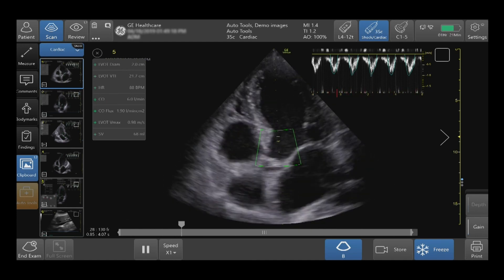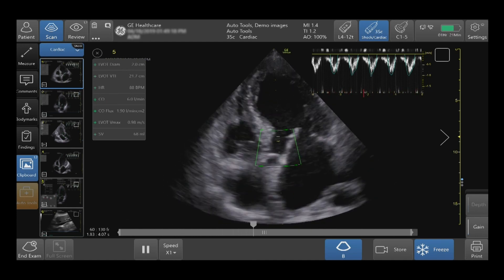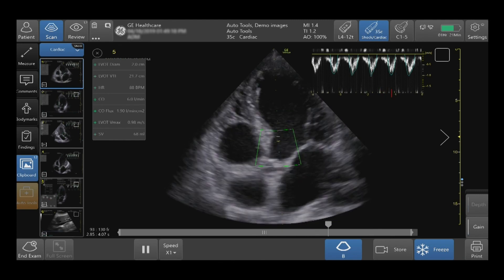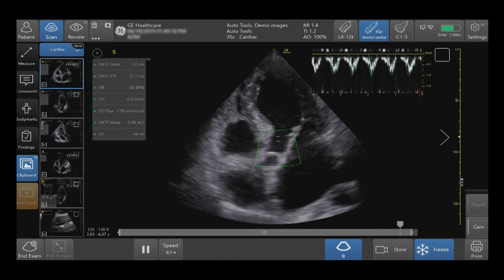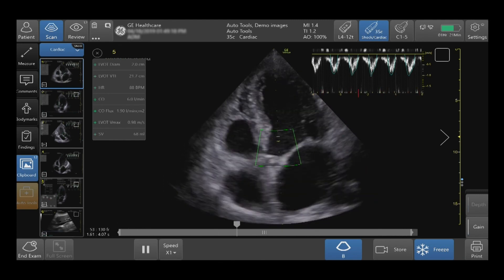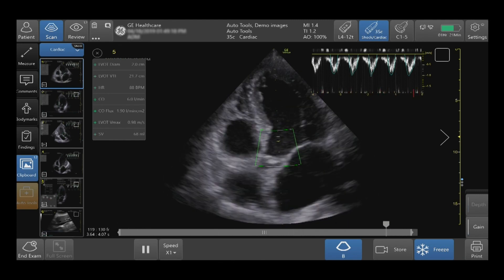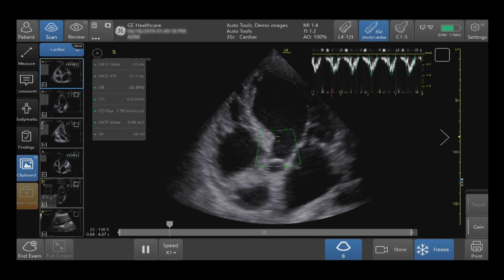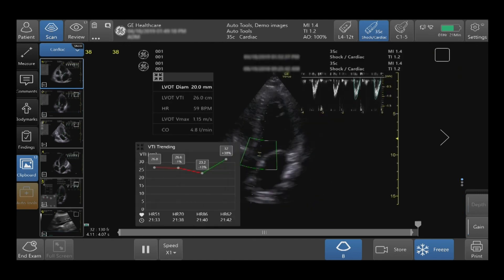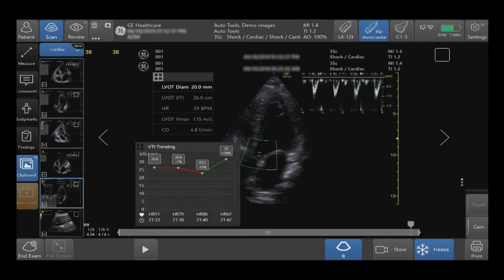If unknown, an LVOT diameter will need to be acquired. VTI Trending is a tool that will allow you to quickly visualize and trend over the course of time, and it will help determine the next course of action and treatment.